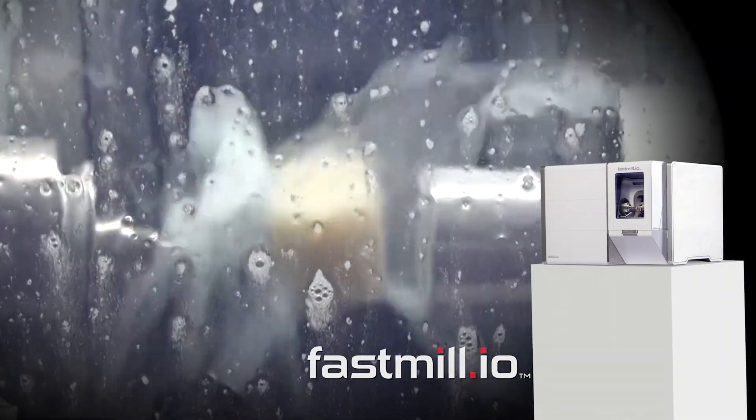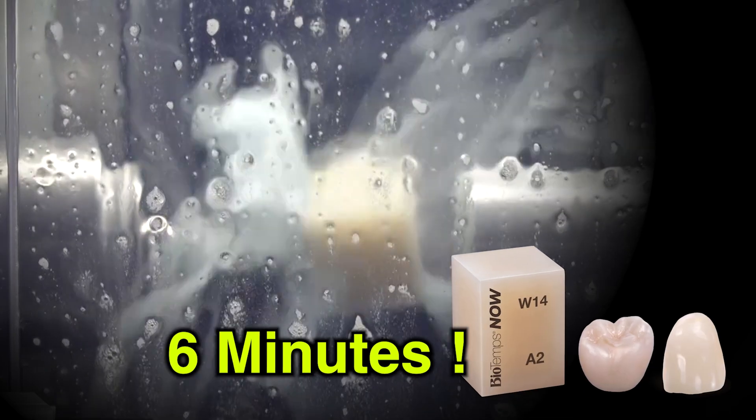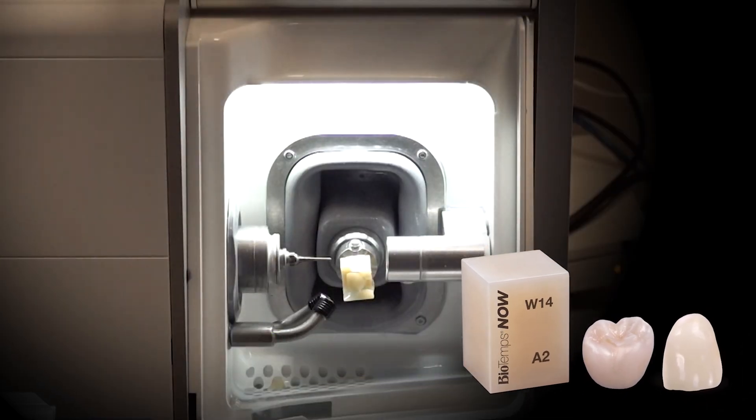The designs are then transferred to the Fast Mill, where it'll take six minutes to make a perfect fitting provisional out of the BioTemps Now blocks.